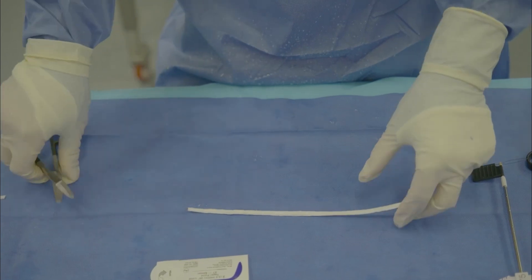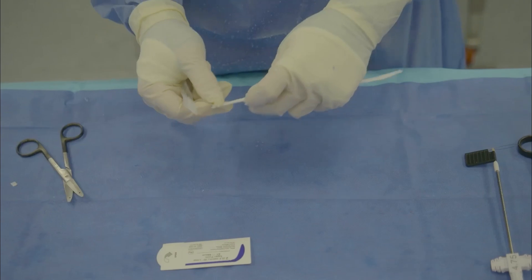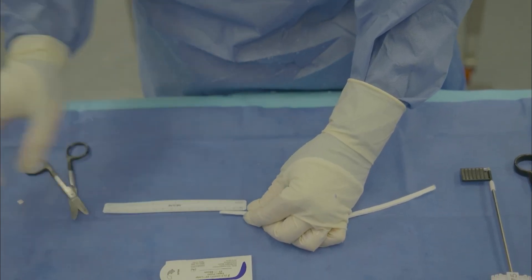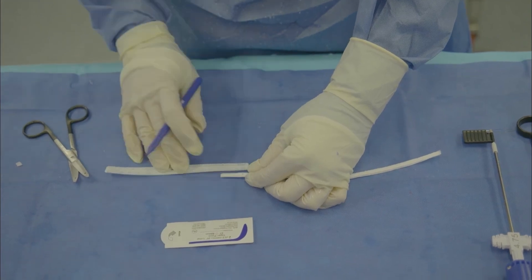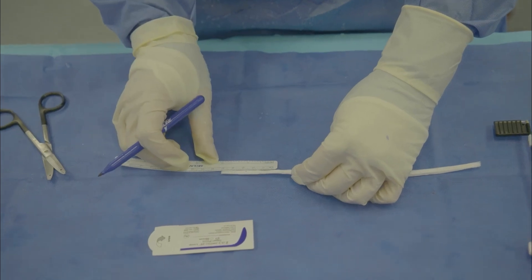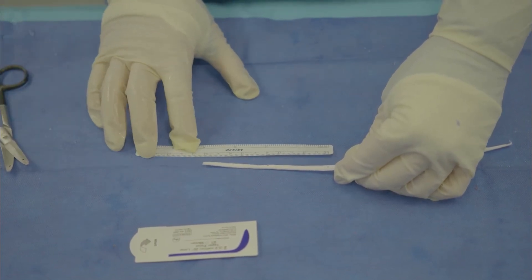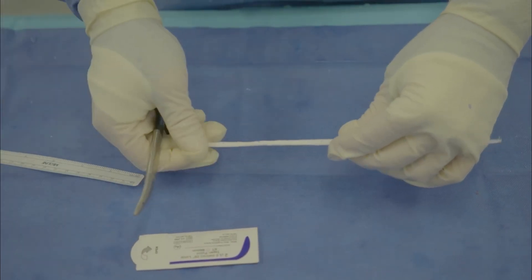When I'm doing a cuff augmentation with the BioBrace strand, I'll usually prepare 25 millimeter segments. We'll measure out the appropriate segment length. You can mark it with a ruler here, and just to make things easier, you can prepare multiple segments at the same time. I've prepared this BioBrace and marked out 25 millimeter segments, and we're going to go ahead and cut them at the indicated marks.